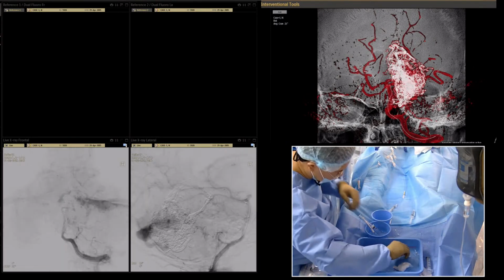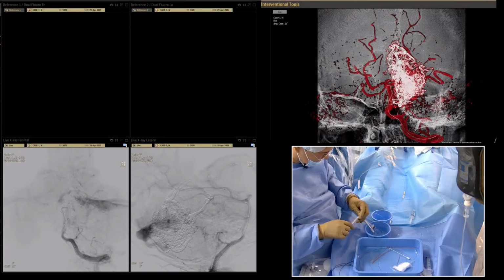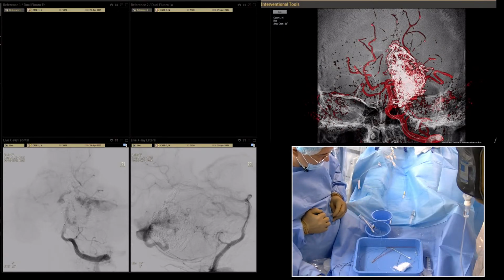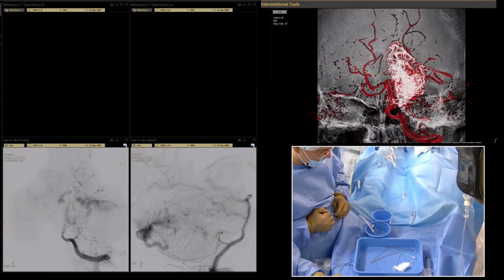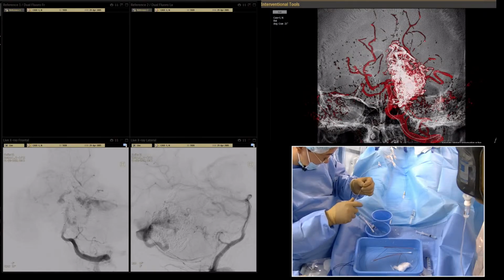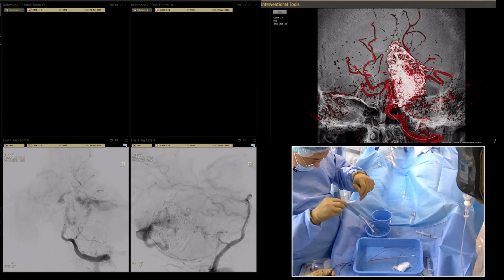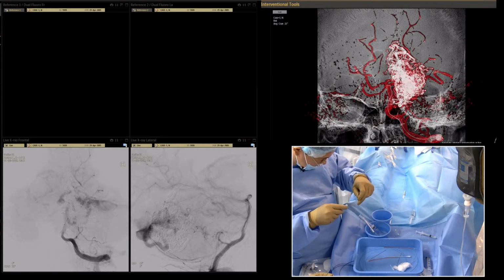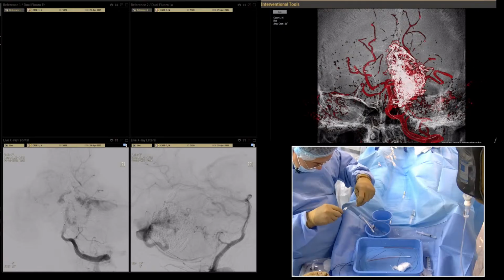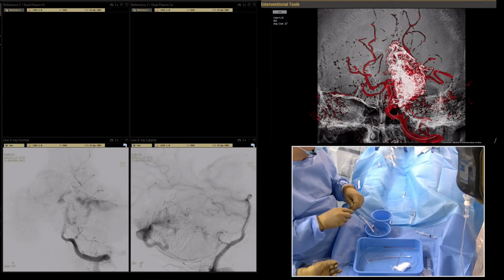Okay, we need to flush it. The second Sonic is 1.225. It's a shorter tip, as the hybrid is nearly dead. Still possible to use. The only problem is it was a Hybrid 7 only from the box. It was the last hybrid. Okay.